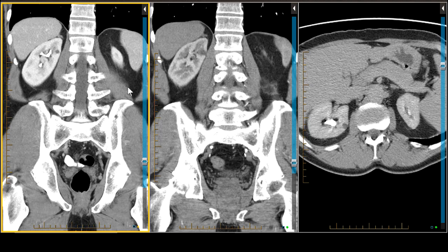The most classic reason why we go to MRI is to determine whether there is enhancement. While that seems like an easy task, it's sometimes very difficult. We tend to start with CT imaging. The criteria we use to determine whether something is purely a cyst: we start with Hounsfield units. Placing measurements and region-of-interest curves on a lesion helps determine if it's a cyst or not. Anything less than 20 we can confidently ignore.